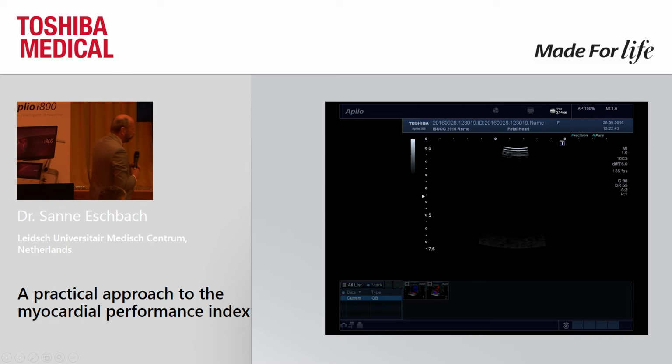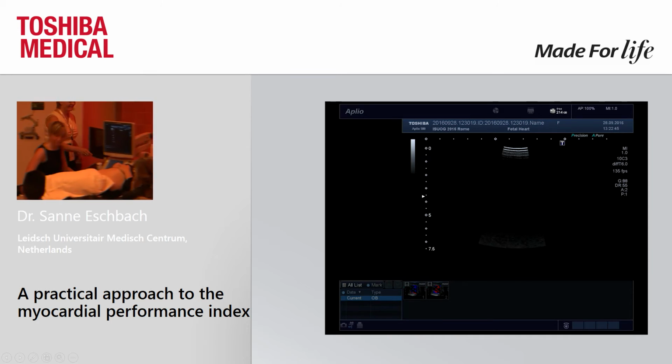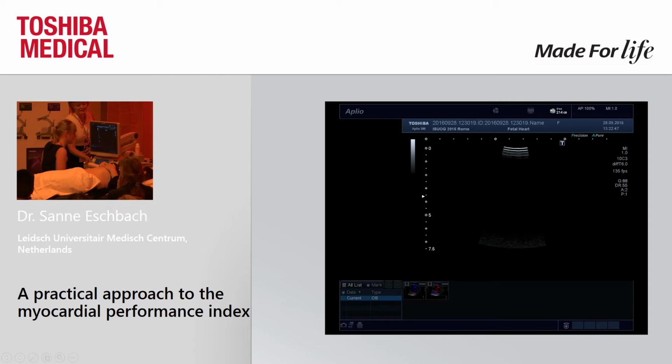Okay. Good questions, but let's focus on the patient. Let's see if we can scan this fetus live. It's about 22 weeks of pregnancy.